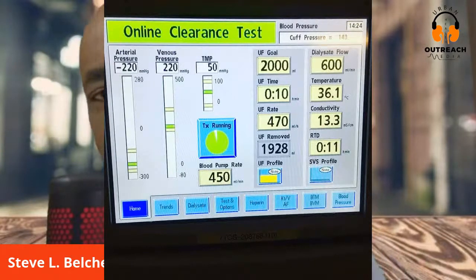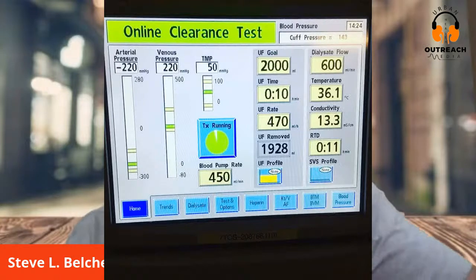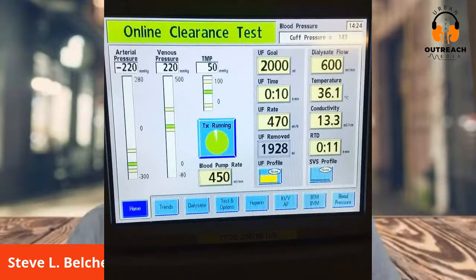So when you come down where you see the 600, that's the dialysate flow. That's how fast the dialysate, which is the bath, is coming through. Temperature is the temperature of the machine. Some patients say the tech and the nurse lower the temperature. Sometimes we do that if the patient's blood pressure is low, because when we lower the temperature, it makes the patient shiver and increases the blood pressure.